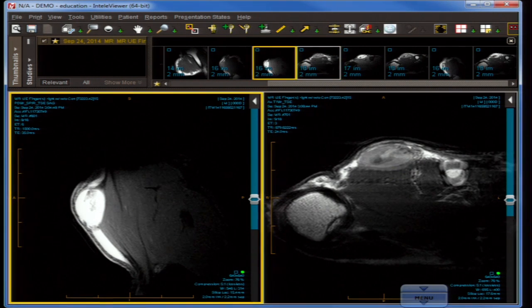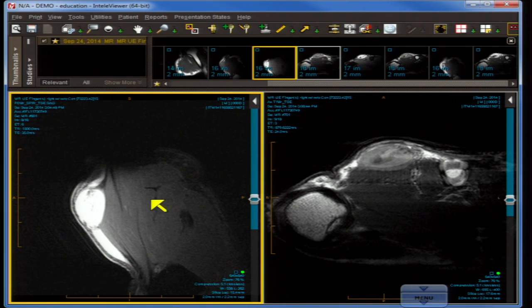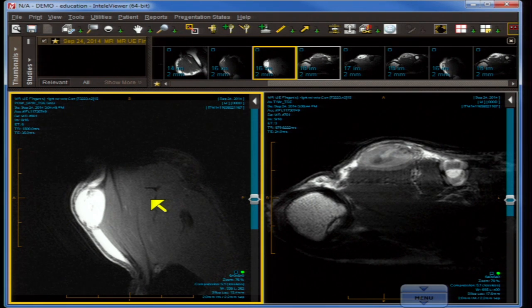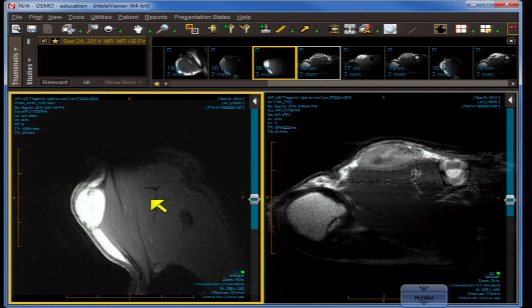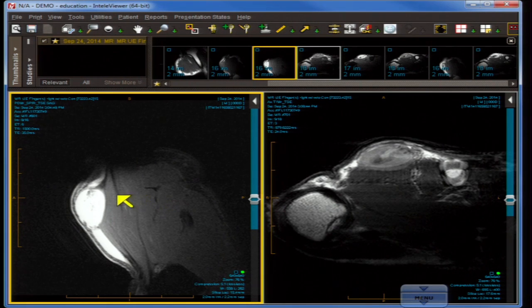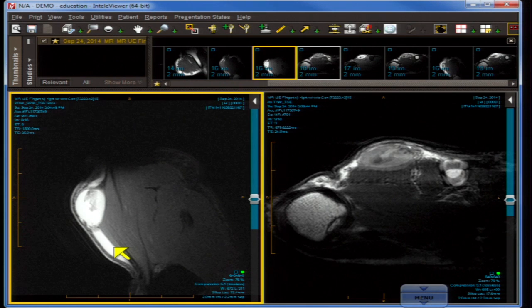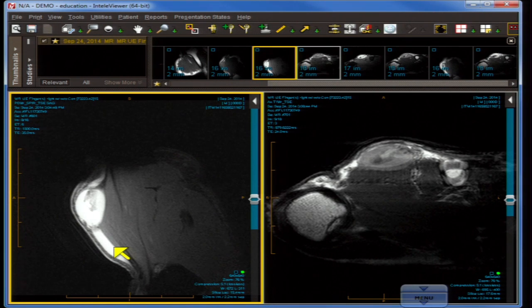Most importantly, when we look in the long axis projection, we see that our mass has a tail. Which masses have tails? Masses that are attached to or come from other objects. A ganglion pseudocyst has a tail going to tendons or a capsule; a schwannoma has a tail to a nerve; an aneurysm or pseudoaneurysm may have a communication with an artery. Our mass has a communication both distally and proximally with a large superficial vein — making the diagnosis straightforward: a giant varix. This explains the higher T1 signal, the area of low signal inside representing a contractile clot, and its overall shape and fluctuant behavior on palpation.